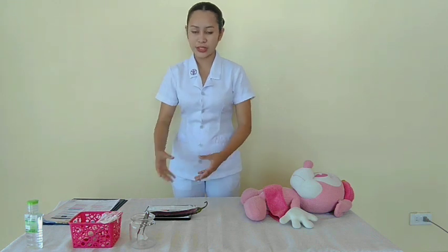Now I'm going to perform the subcutaneous medication administration. After preparing the medication, head over to the patient's room, introduce yourself to the client, verify the patient's identity using two identifiers, explain the procedure to the client and ensure the patient's privacy.